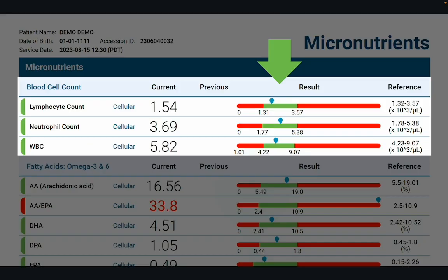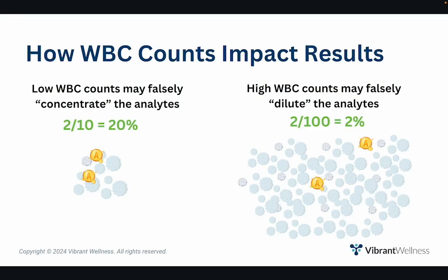Moving on to blood cell count: the micronutrient test measures and reports total white blood cell count, neutrophil count, and lymphocyte count so you can critically interpret results. Normal white blood cell counts are needed to ensure accurate results, as intracellular results are calculated and expressed as a ratio of total white blood cell counts. If white blood cell counts are out of range — too high or too low — low white blood cell counts may falsely concentrate analytes, resulting in false highs (e.g., 2 divided by 10 is 20%), while high counts may falsely dilute them, resulting in false lows (e.g., 2 divided by 100 is only 2%). You can simply shift the values left or right on the graph based on very high or very low white blood cell counts.